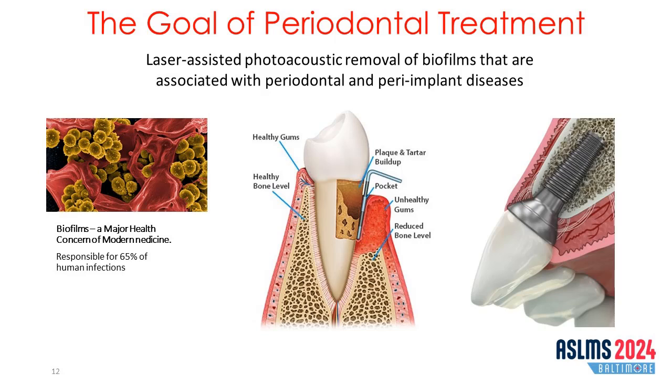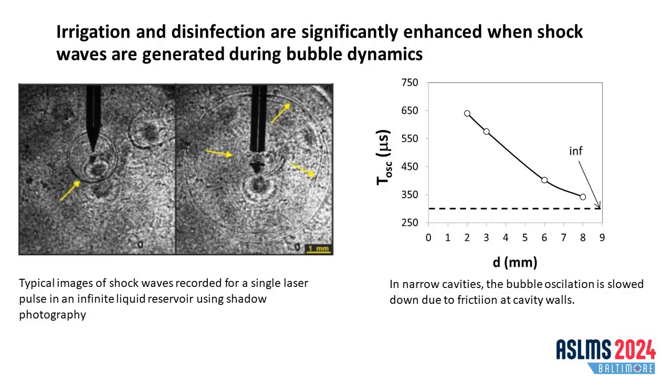There is a similar challenge in periodontal pockets or peri-implant pockets, where we want to remove bacterial biofilms. What we found out is that although there is violent movement of the liquid during this bubble dynamics, even more important is to establish conditions where shock waves are generated following bubble collapse.